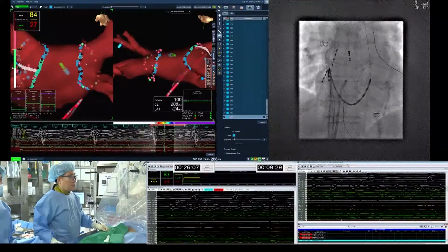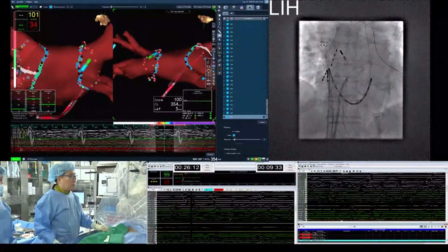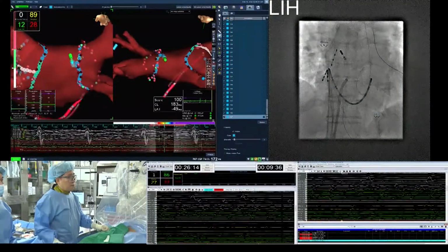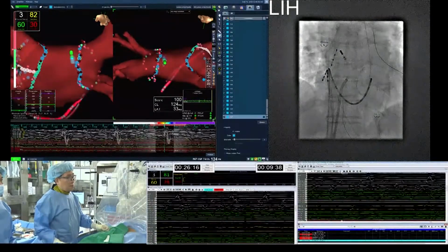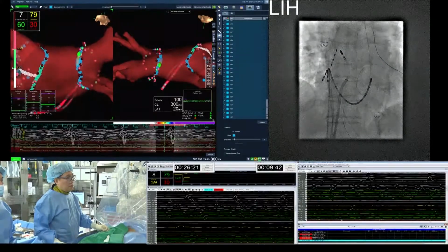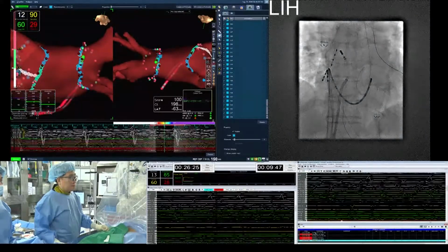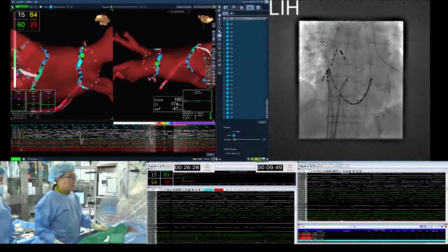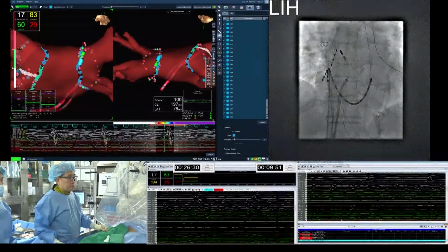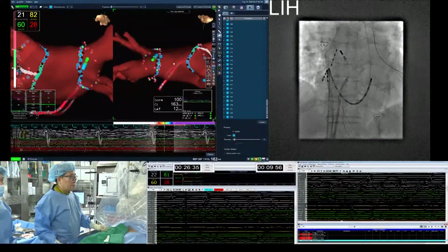Even though at this point the patient respirates vigorously and catheter stability may change, take your time and give RF energy, with sophisticated technique, and fill up all the gaps, and finally successfully generate the right side antrum ablation.